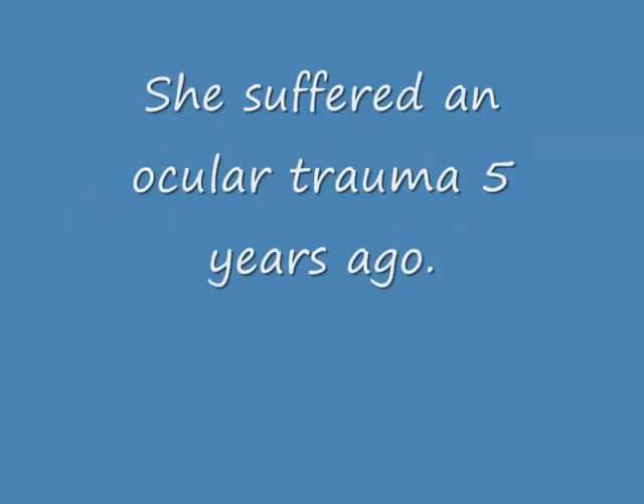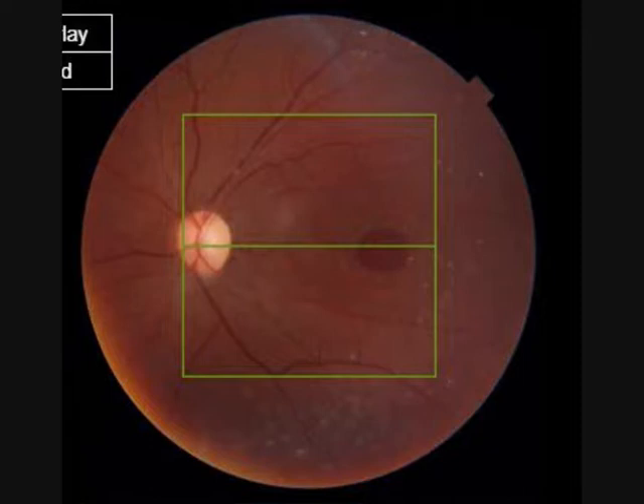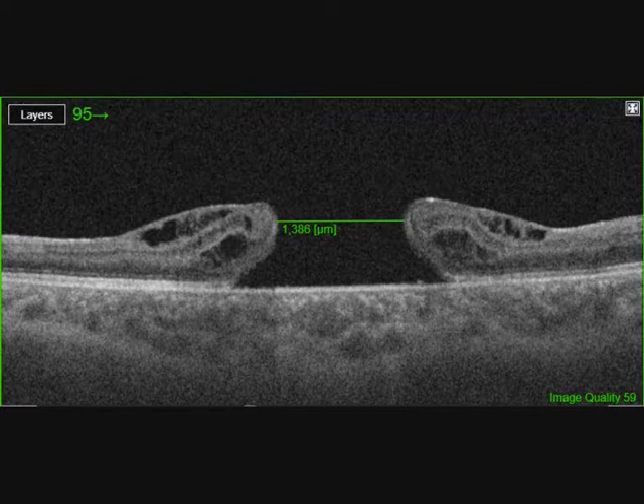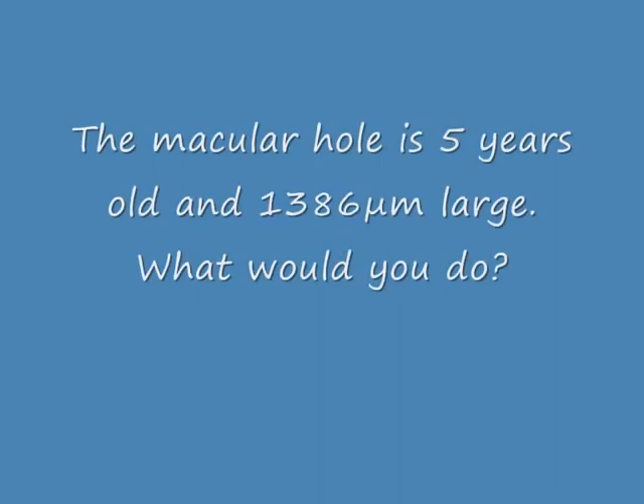This is a vitrectomy for a large macular hole from old macular trauma. The eye is already vitrectomized. Here you can see the big macular hole and here the OCT — this is a five-year-old hole.